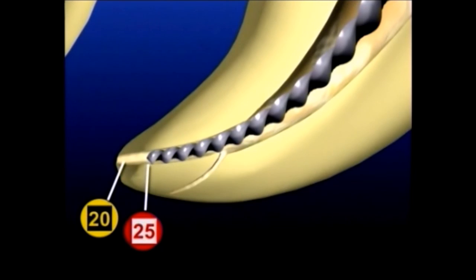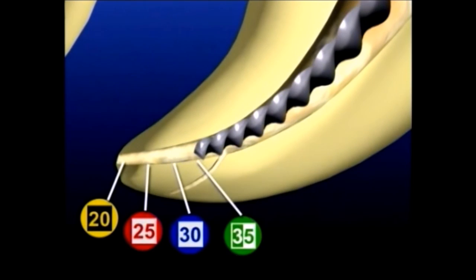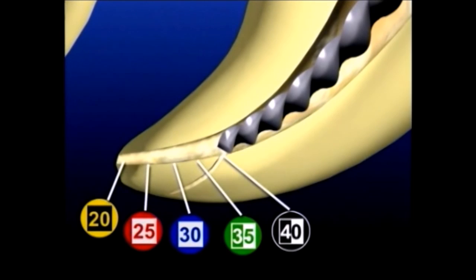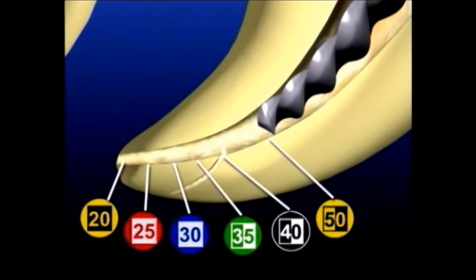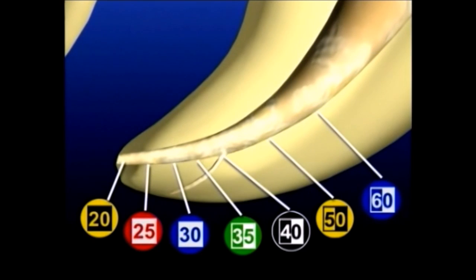Tuning is the clinical activity of recapitulating through a series of successively larger instruments and working them until they are observed to uniformly back out of the canal. The interval of backout between successively larger files should not be greater than 1/2 millimeter. The file that snugs in at length only represents the true most apical cross-sectional diameter of the canal if each progressively larger instrument uniformly backs out of the canal in 1/2 millimeter intervals. Gauging and tuning verify deep shape and are an opening for cone fit and packing in 3 dimensions.